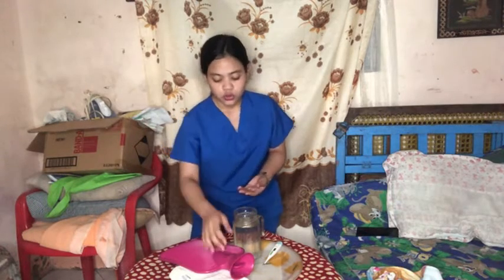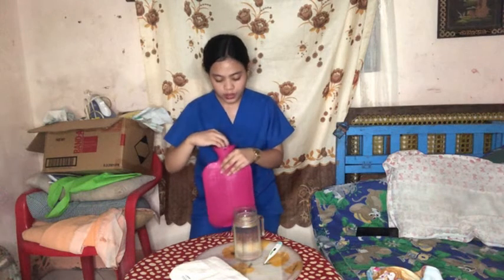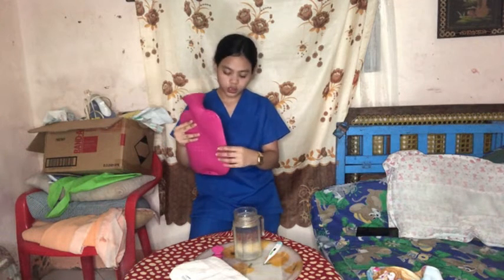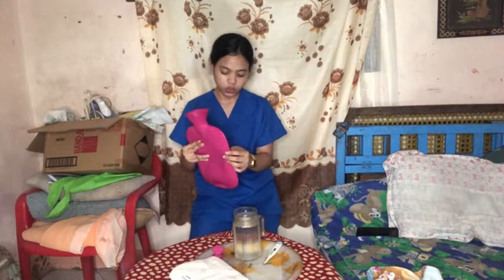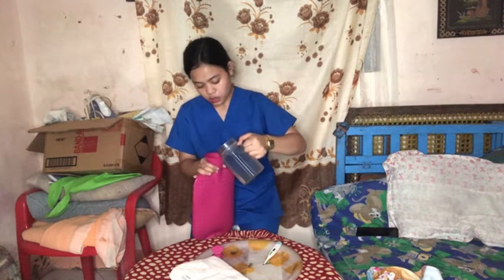Okay, then next we are going to fill the bag about 2/3 full. So I'm just going to fill the water into the hot water bag to 2/3 full. We need to measure it. So 1, 2, 3. This is the point of 2/3 full. I'm just going to fill the water into the hot water bag.